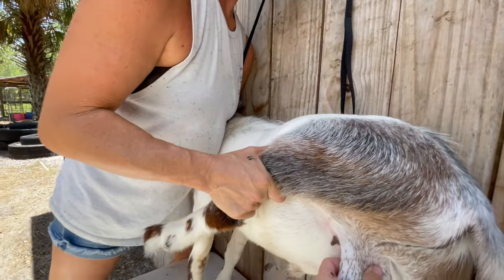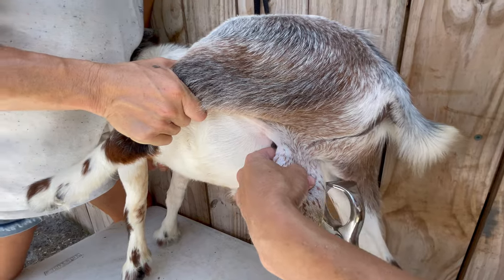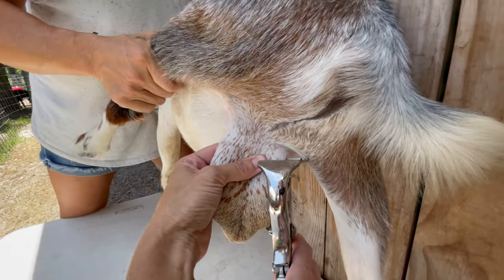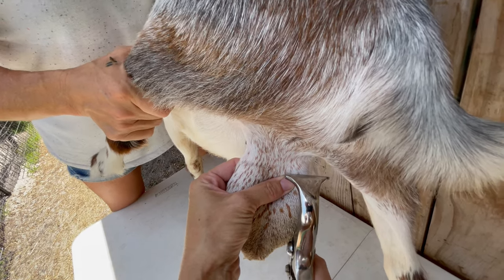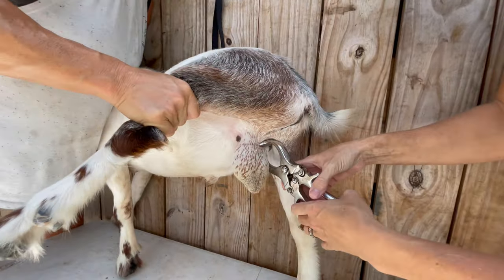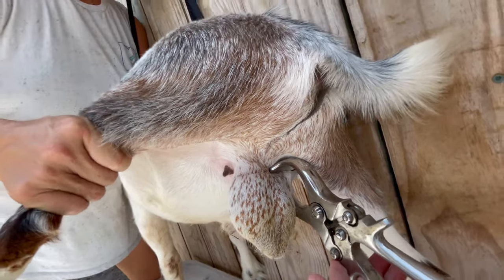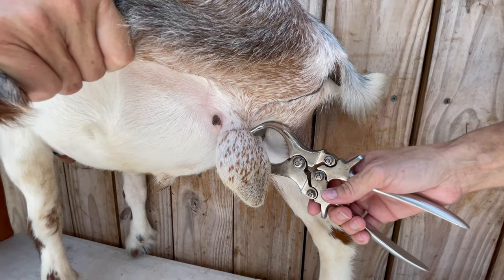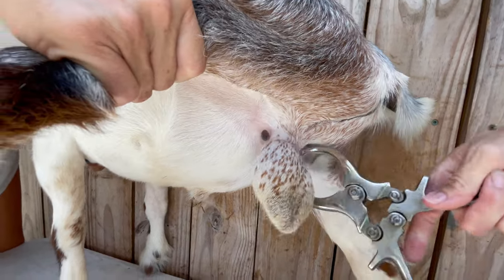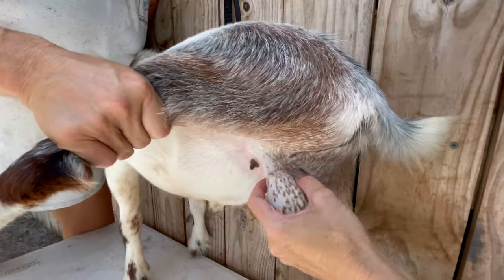I'm right-handed, so here are the teeth — I put that on the bottom. You can feel the cords in here; scoot them all the way over to the side, and I use my thumb to push against that tooth underneath, just lightly. Notice how I don't go straight across. I clamp right here and hold for 10 seconds. He's alright — usually it's the initial pinch that hurts a little, but they're not complaining the whole time the clamp is on. You do have to push the clamp all the way until you feel it kind of click, like vice-grip pliers.